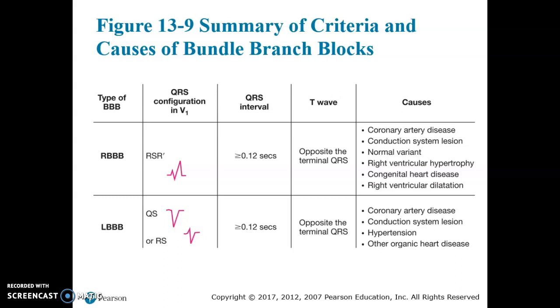This is a slide. It's pretty much everything that we just went over. It does add some causes here that I want you guys to look over. But know your QRS intervals here, and know this criteria when you're determining whether the patient has a block or not. This is very important.